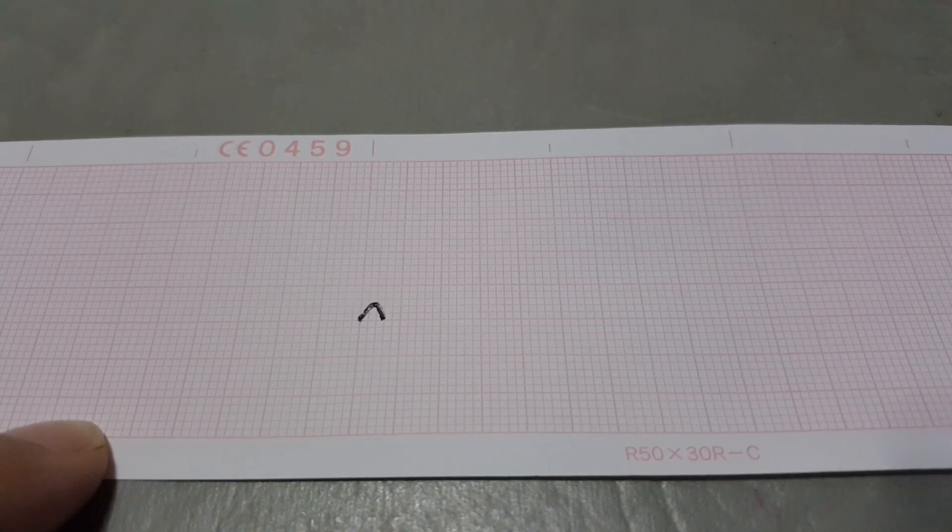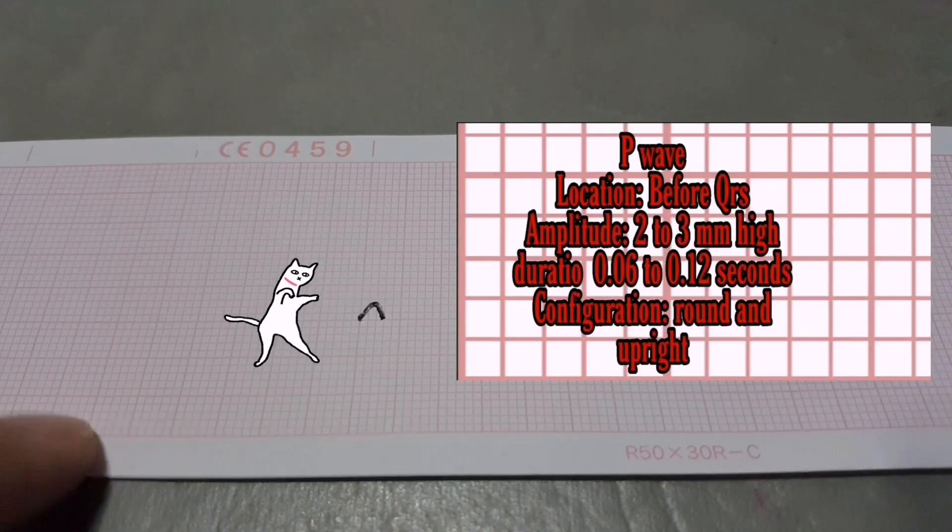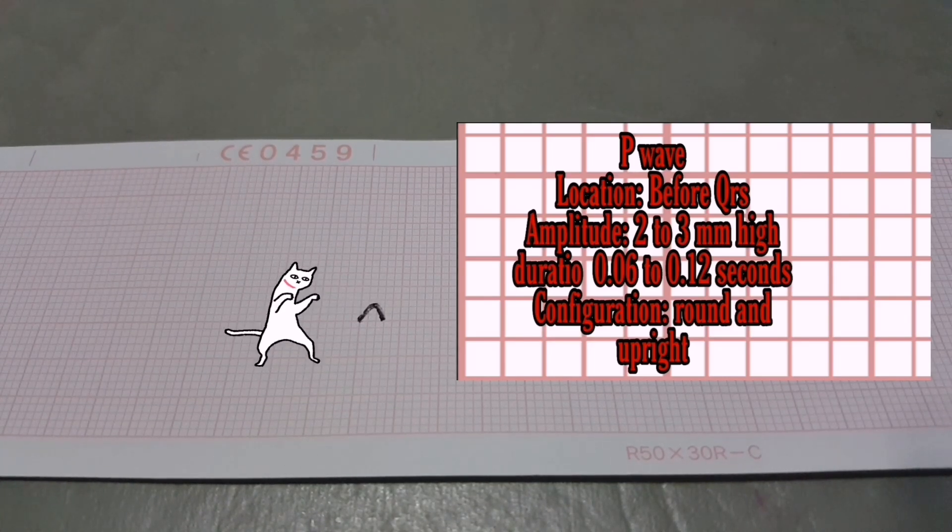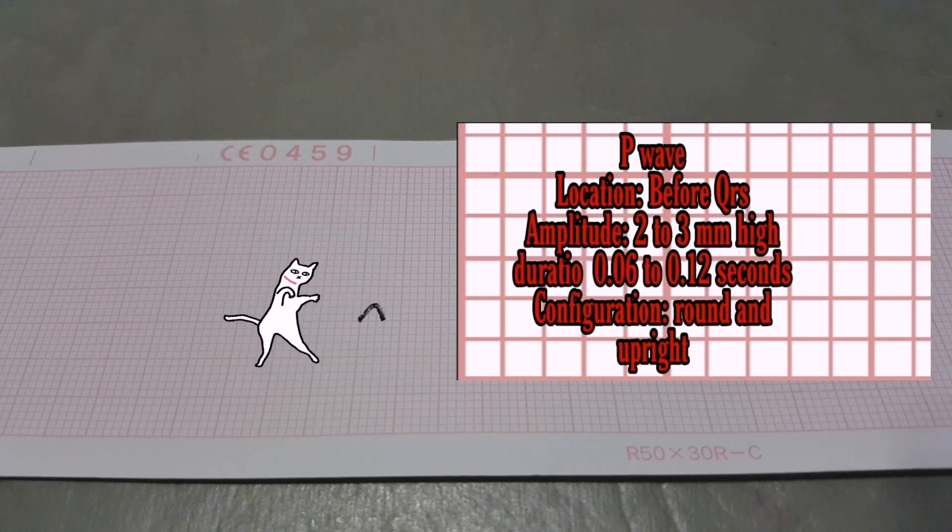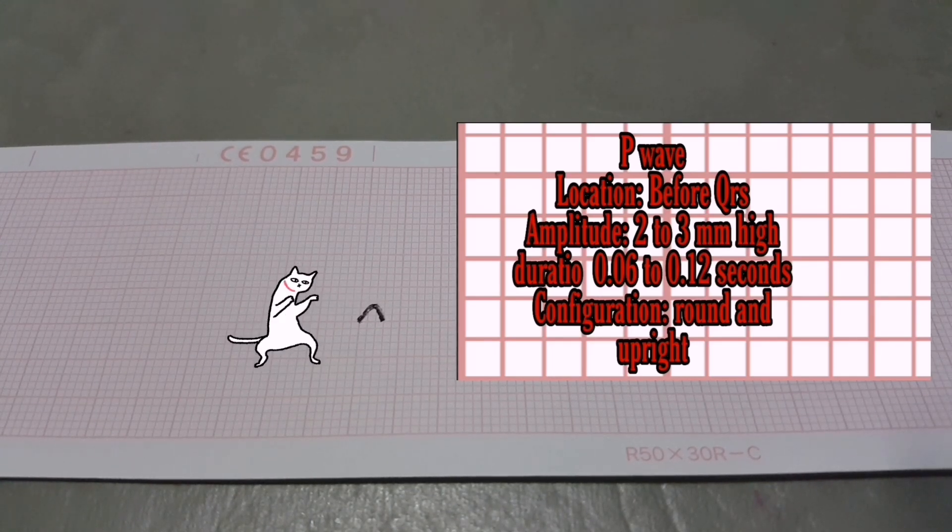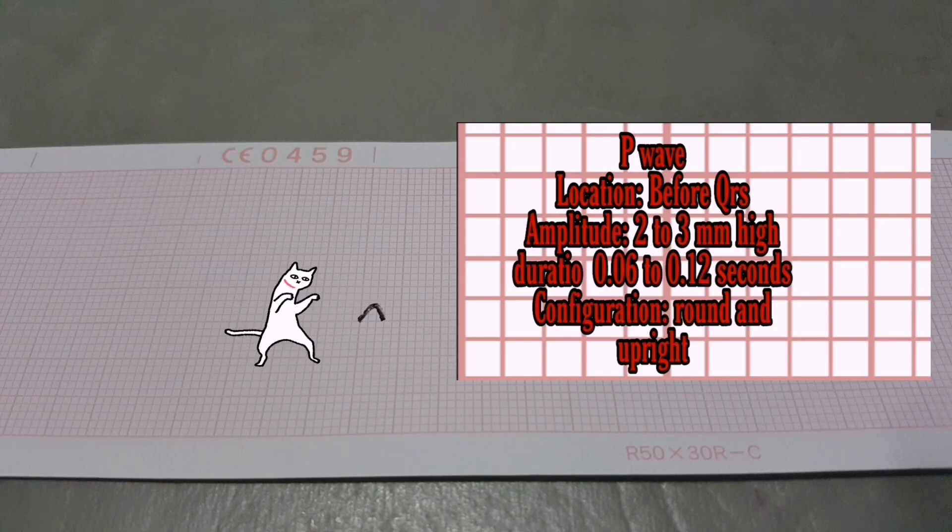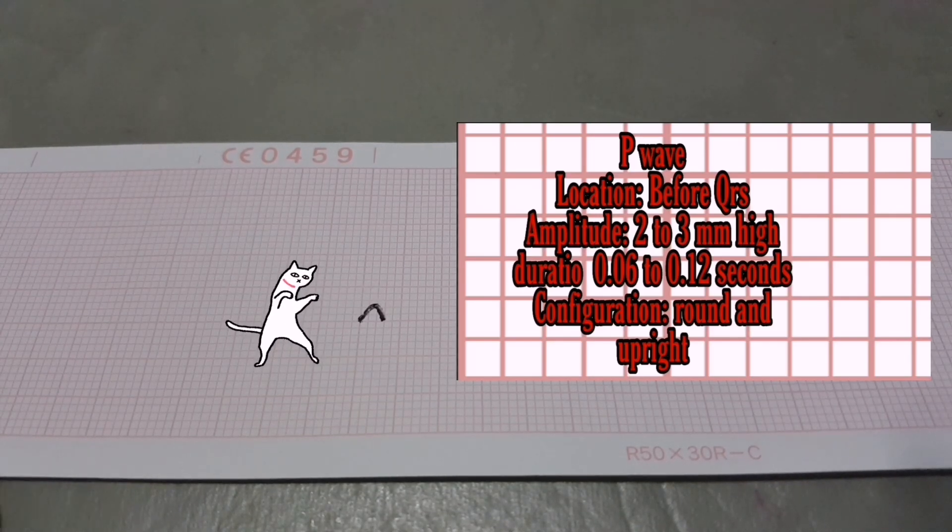The P-wave represents atrial depolarization. It occurs before QRS complex, amplitude 2 to 3 millimeter high or 2 to 3 small boxes high. Duration, 0.06 to 0.12 seconds or 1.5 to 3 small boxes. Configuration, rounded and upright, deflection, upright, or positive in all leads except in AVR.